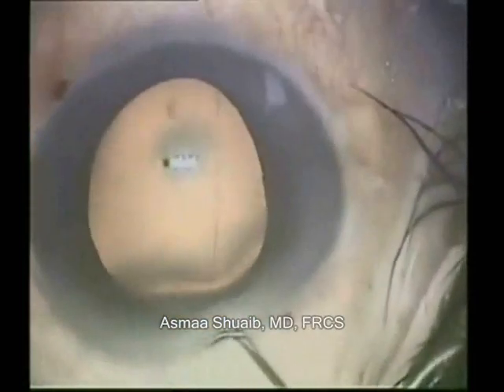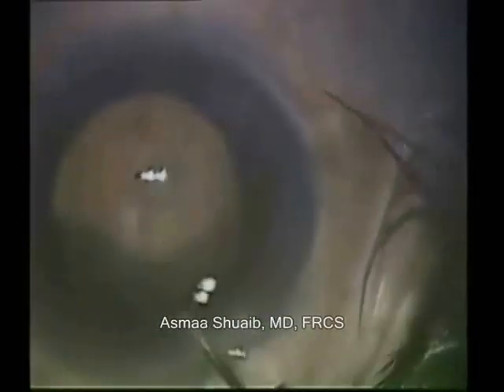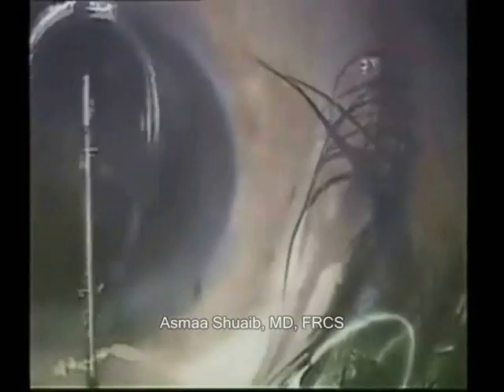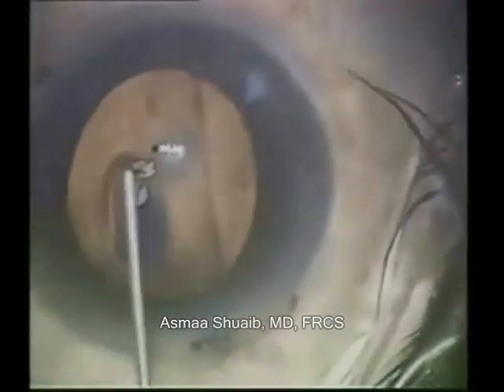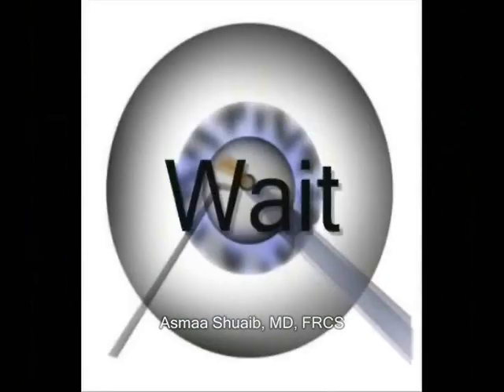First, by evacuating the Visco from the anterior chamber and replacing it with saline. Then, he used the stain to visualize the movements of the Descemet's precisely. After that, he did massaging of the cornea to reposit the Descemet's in its place. And to keep it in place, he did Descemetopexy with a large air bubble that was introduced with monitoring of the intraocular pressure. The surgery was aborted at this point, with the decision to re-operate after healing of the Descemet's.